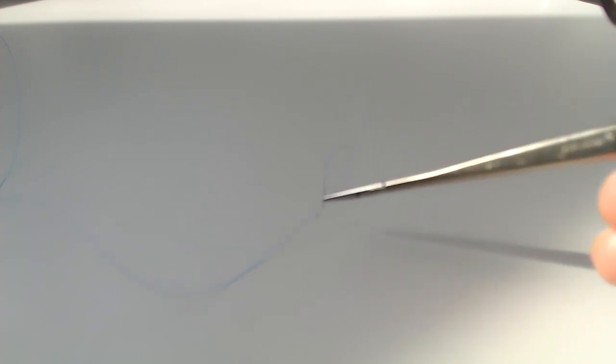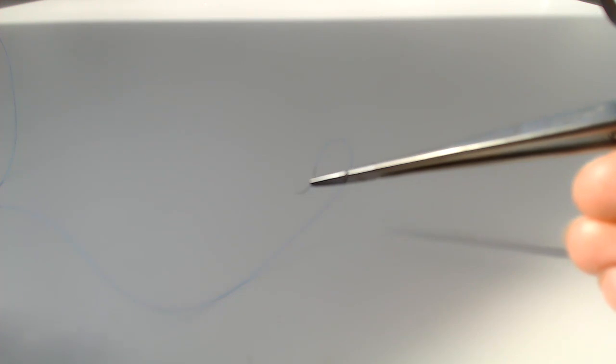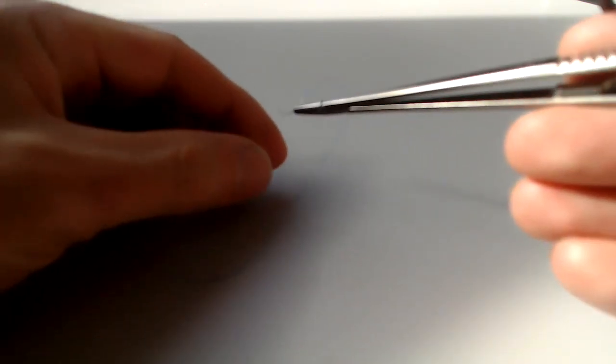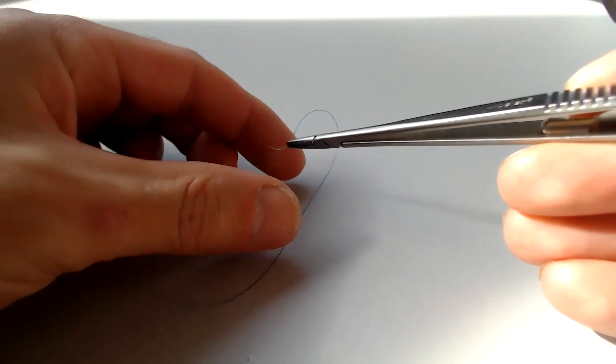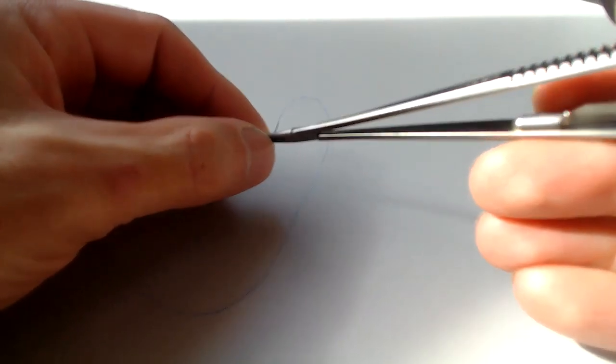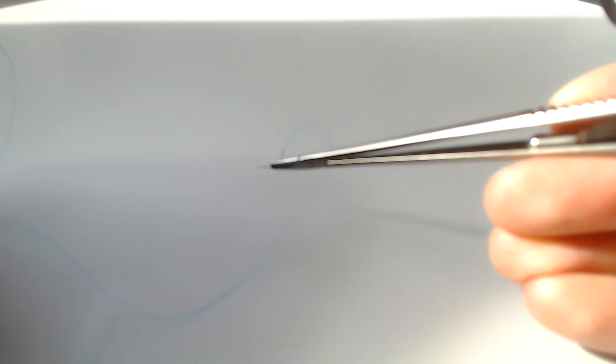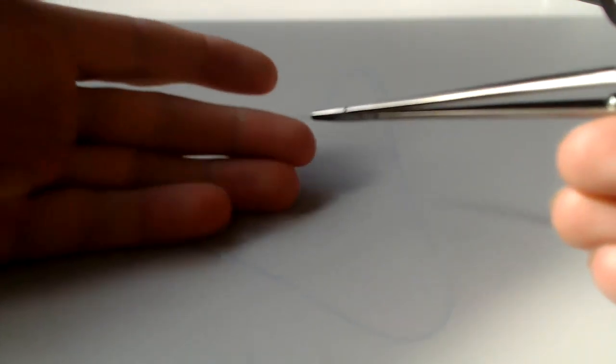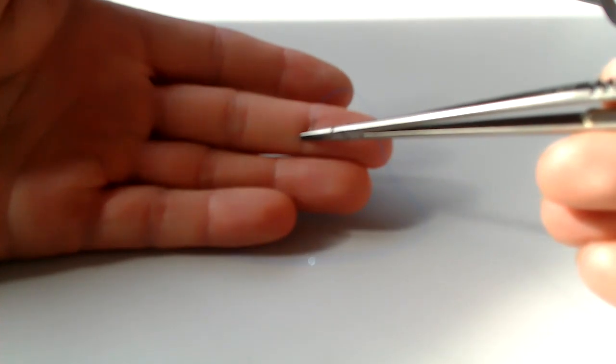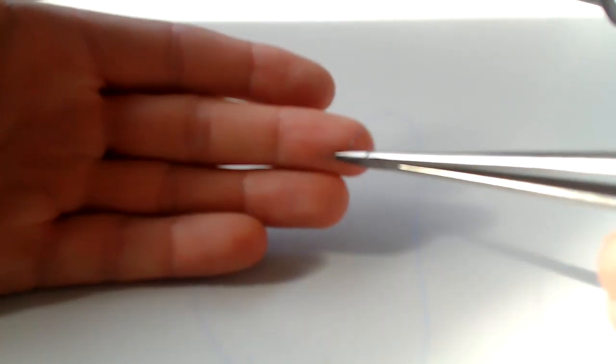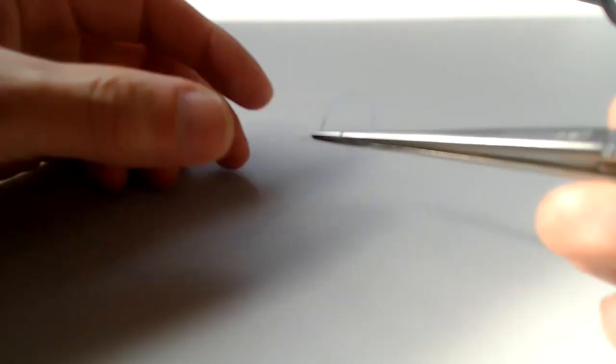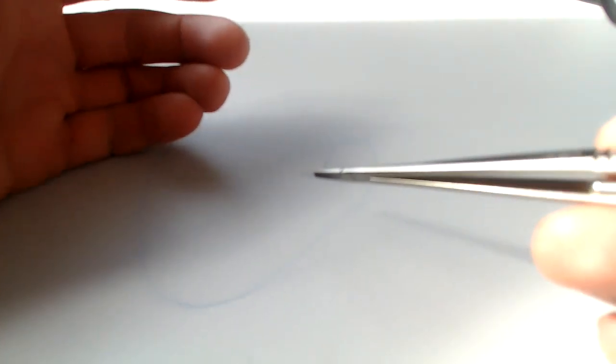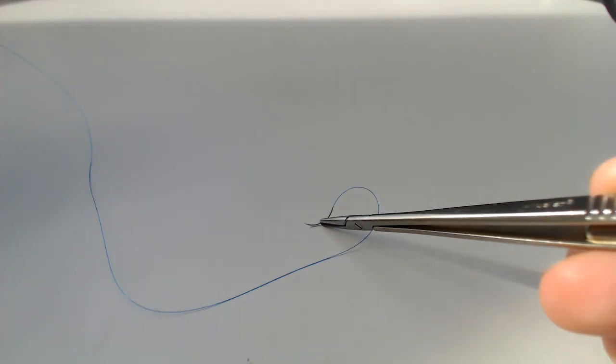So forward angulation at the tip of the needle driver. And then one other variable for the most part, again, the default should be about halfway on the curve of the needle. This is a three-eighths needle, a C1 needle. I'm talking about about half of the length of the needle. Sorry about the autofocus here.